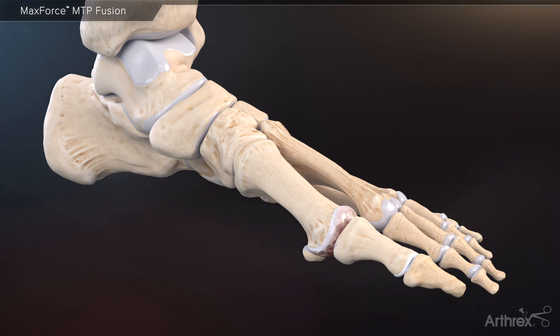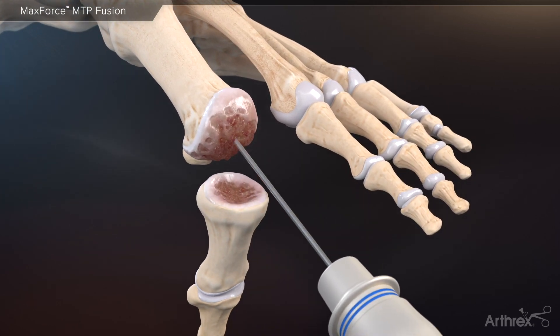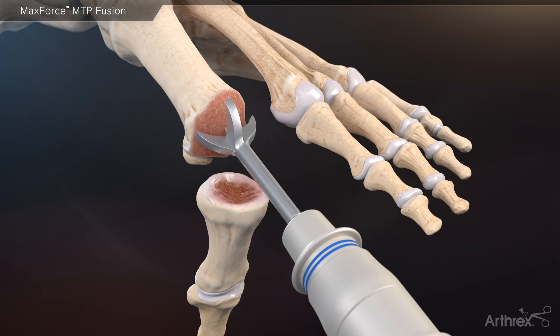Arthrex introduces the MaxForce MTP plate for fusion of the first metatarsophalangeal joint. Initially, prepare the joint for fusion by using the cannulated metatarsal and phalangeal reamers. It is important to remove all remaining cartilage from both joint surfaces.